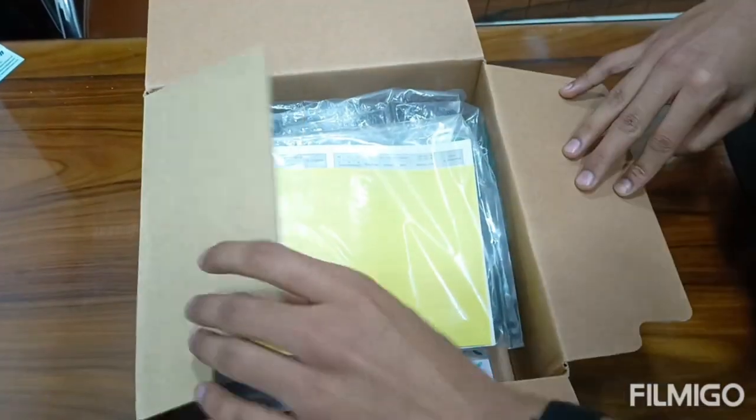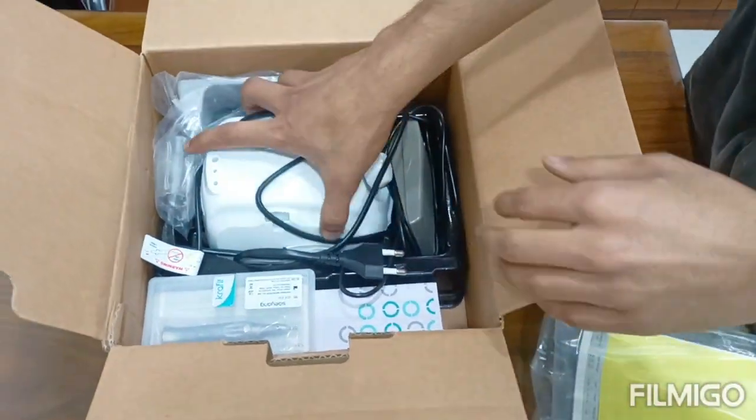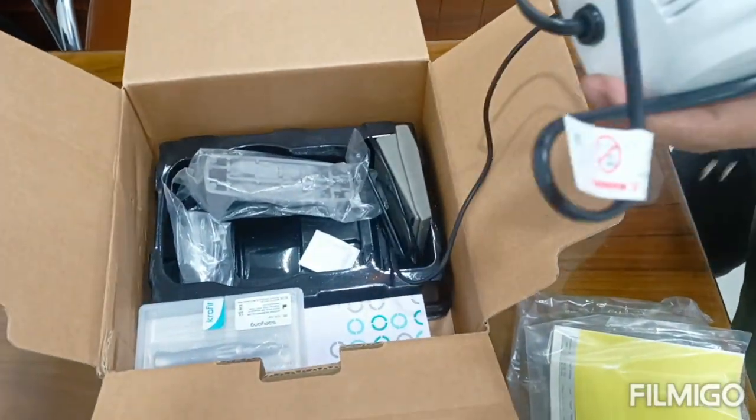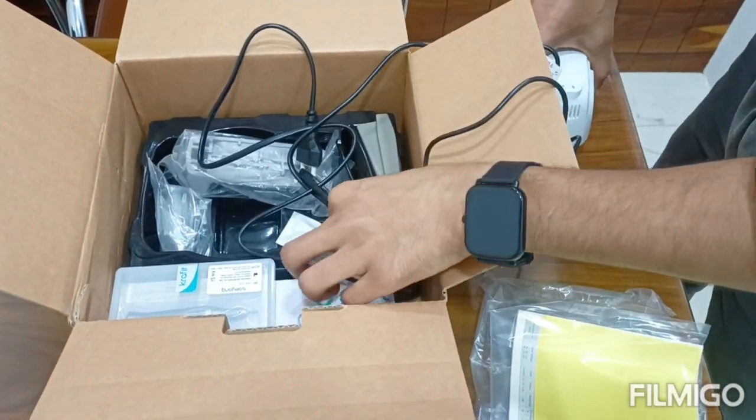Hello friends, I hope you are fine and well. Today we will learn about how to use the Micro Marathon Motor MK3, with 35,000 RPM rotation per minute.